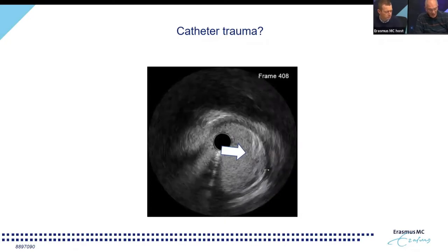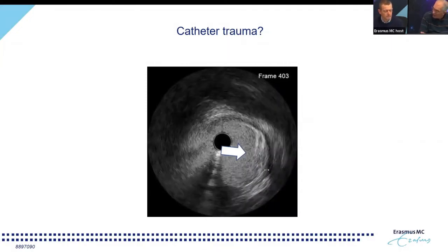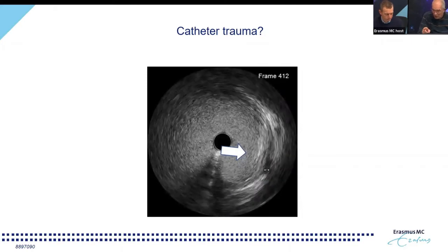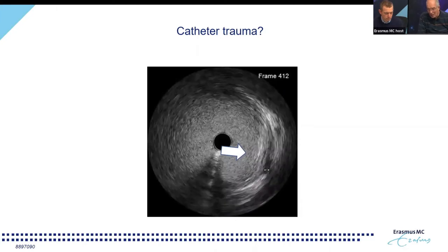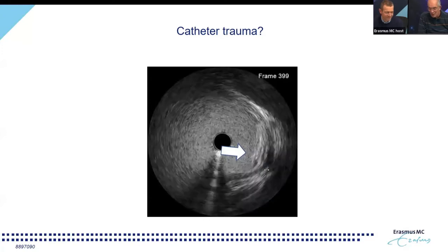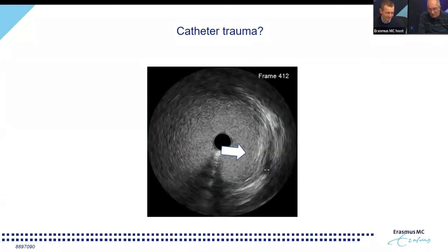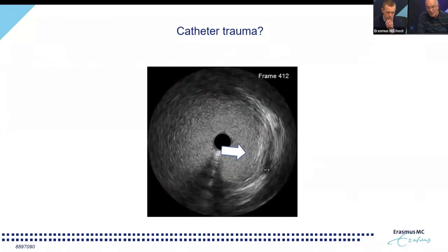Yeah, exactly. And I think that is a spot where the diagnostic catheter was going in the roof, and you could see this small mountain there. And that is why we always say, if your catheter is not fitting like that, please take another catheter. And that's also why we always check the left main with the last pullback, where we disengage the guiding catheter to see if we can see some disruptions in here.